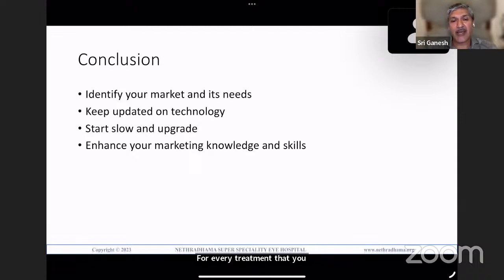It was like buying a car and then paying for the meter to run it like a taxi, which was again very foolish, because if you looked at the post-op outcomes between normal LASIK and wavefront LASIK, there's not a huge difference. So you have to use your scientific knowledge and your common sense when you're evaluating technology, and just don't fall for what these companies market to you. You actually evaluate whether it's good for your patient, whether it's going to improve patient satisfaction and outcomes.